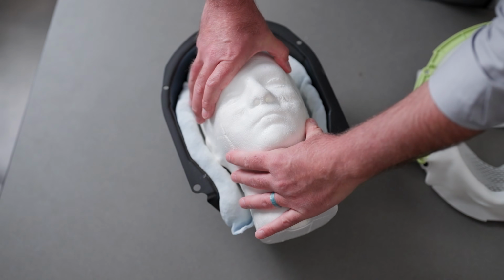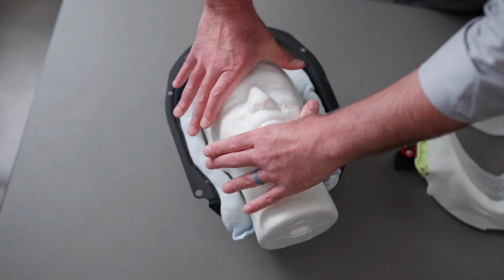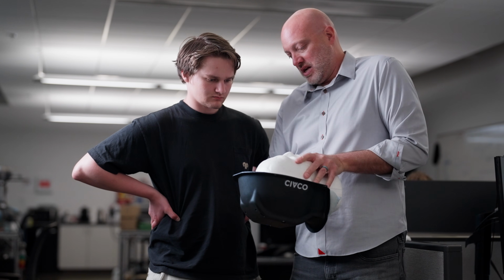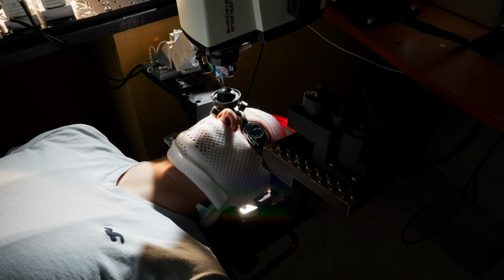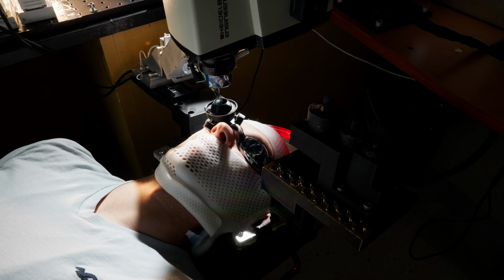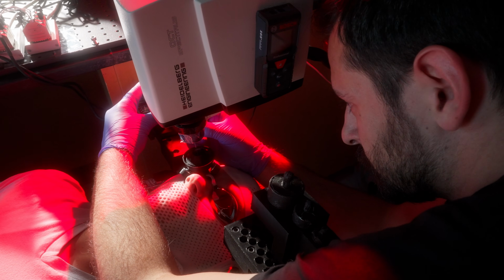To compensate for patients' movements, we have developed a helmet that the patient wears. You've got this helmet that's form-fit tightly to the head. The robot is mounted to that helmet. And so now you have these three things all moving together through space. The robot on the helmet on the head, and they're moving together.